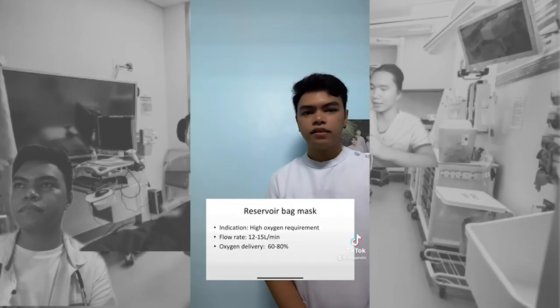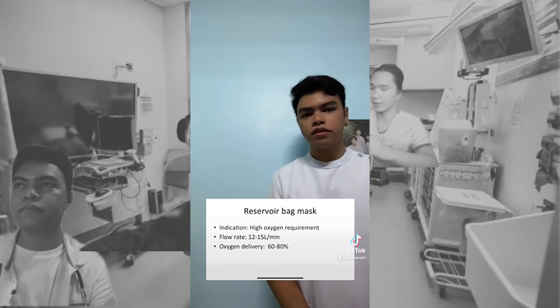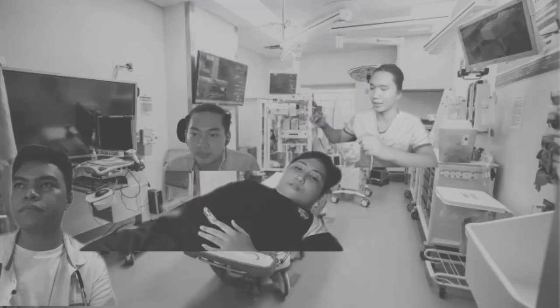It is indicated for patients that need high concentration of oxygen. Ordered flow rate is between 12 to 15 liters per minute.